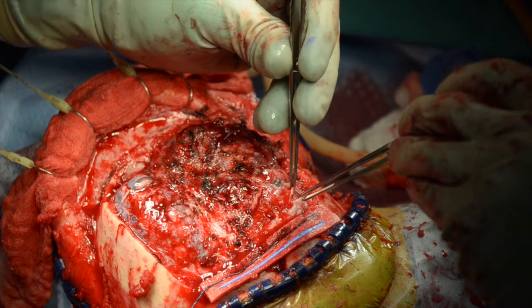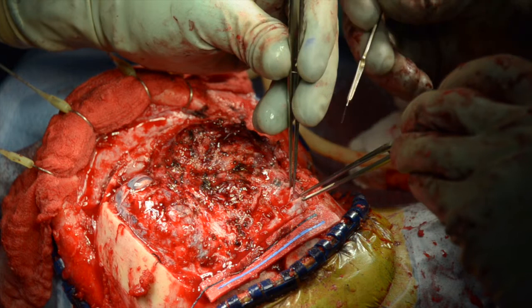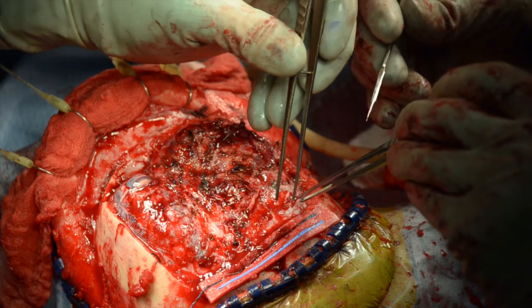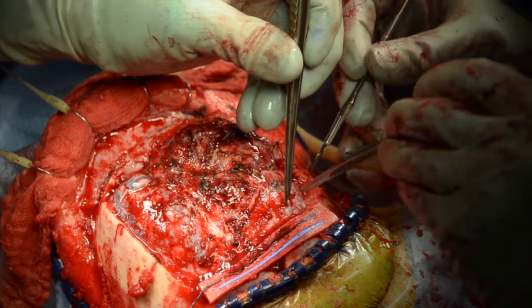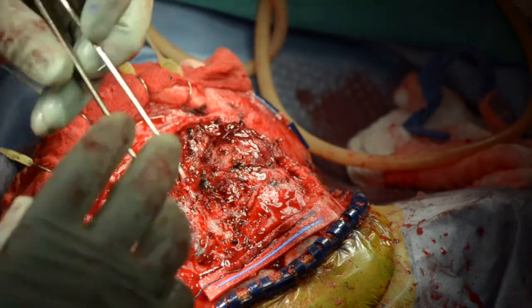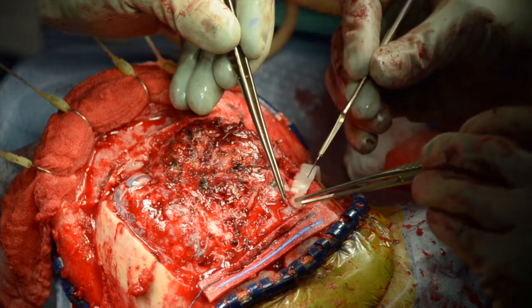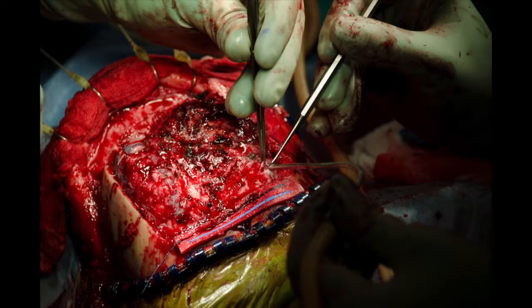The dura is opened laterally using a 4.0 silk suture and 11 blade, and then extended to form a flap that is opened towards the sinus. The dura must be opened sufficiently, right to the edge of the sinus, in order to expose the midline and falx cerebri intradurally. The dural edges are tented over cottonoids to maintain a dry operative field. Wet sponges and towels are placed at the edges of the surgical domain and the Greenberg retractor system is assembled. Exposed brain is protected with Telfa and/or cottonoids.